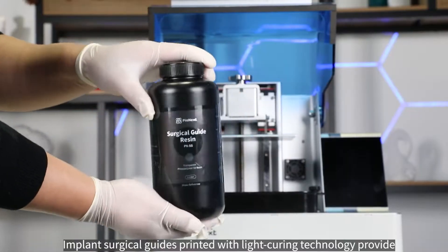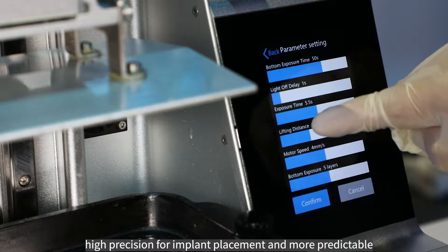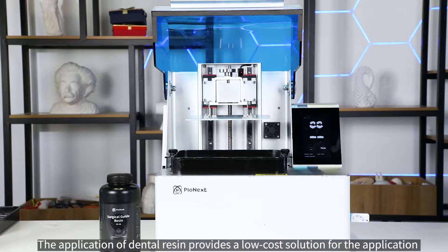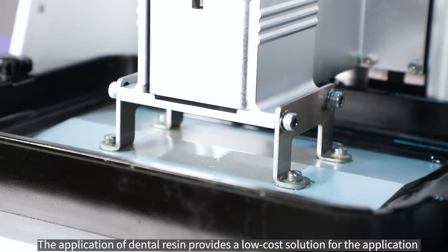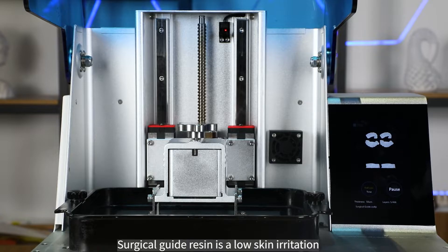Implant surgical guides printed with light curing technology provide high precision for implant placement and more predictable restorative results than non-guided implants. The application of dental resin provides a low cost solution for dental implant guides.